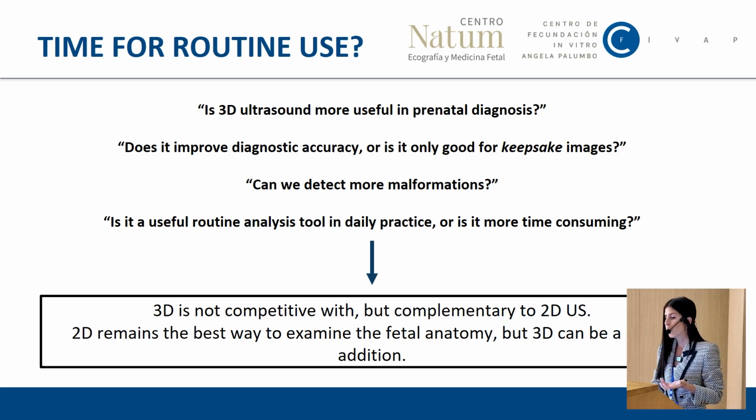Nowadays, most ultrasound equipment has incorporated 3D and 4D technology into its scanning system. So most of us that are using ultrasound machines in our daily practice have 3D and 4D technology included. So where do these questions stand really?